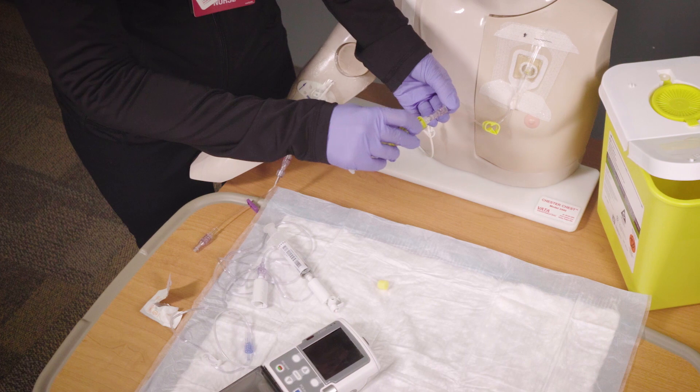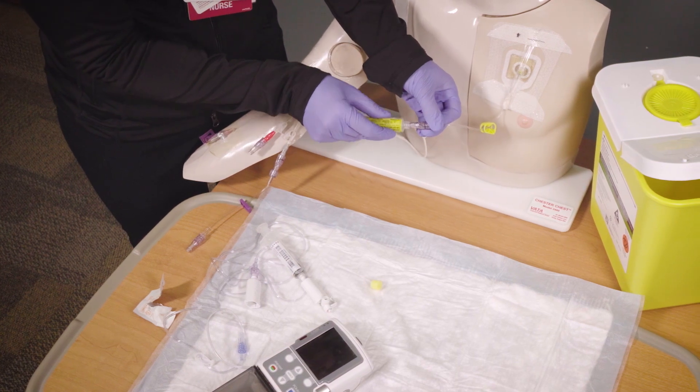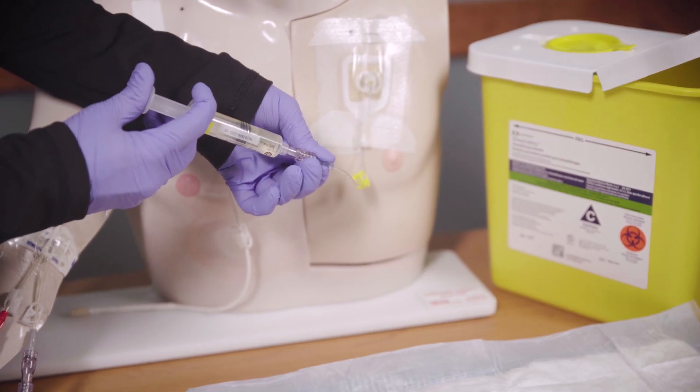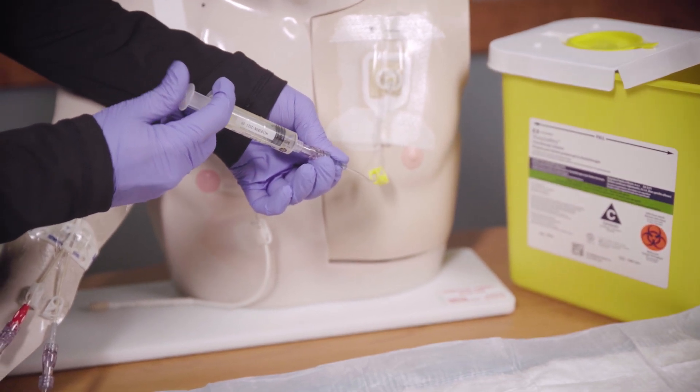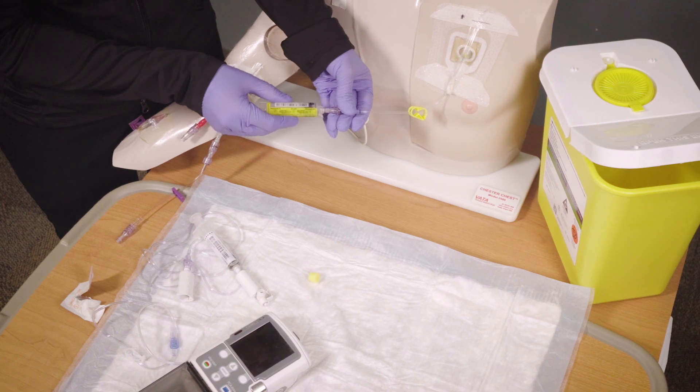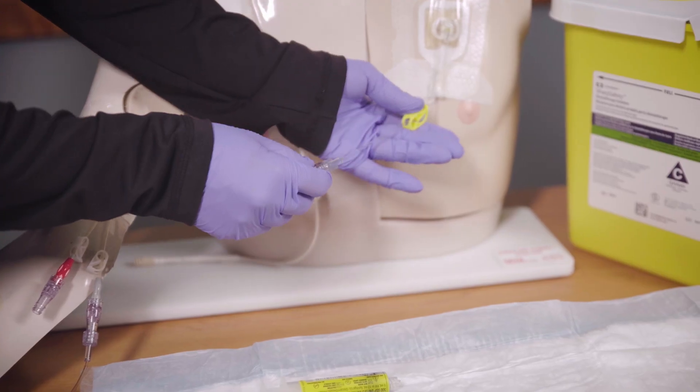Next, attach the heparin syringe to the valve at the end of your central line tubing and flush the tubing using the push-pause method, leaving a small amount of fluid in the syringe. Remove the syringe, then close the clamp on your central line tubing.